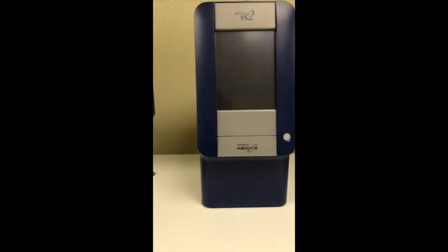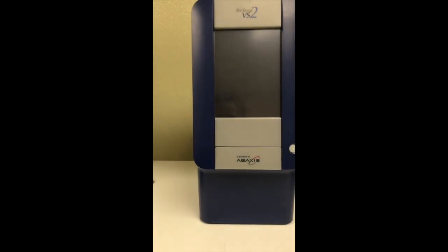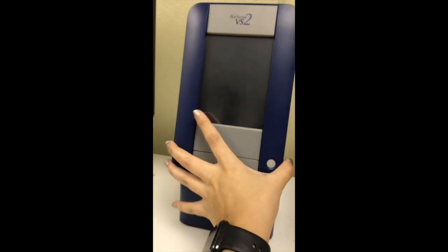The first is just keeping this screen very clean. That's just general maintenance and cleaning. Typically we just use Windex and something soft, typically just paper towels.